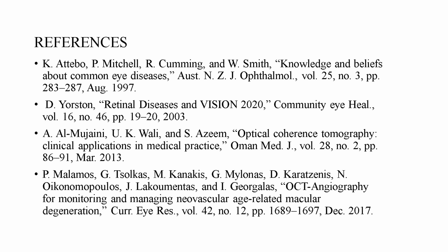At last, I conclude that the proposed method involving regression techniques, as mentioned in the paper, mainly undergoes 4 important stages. In the first stage, the OCT scan images and fundus scan images are pre-processed by means of advanced filtering techniques in order to remove the artifacts that have been added during the capturing of the image. In the second stage, segmentation and clustering are carried out in cascade on the resulting image via edge detection.